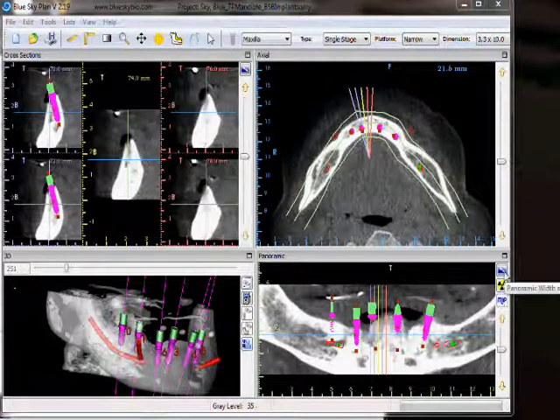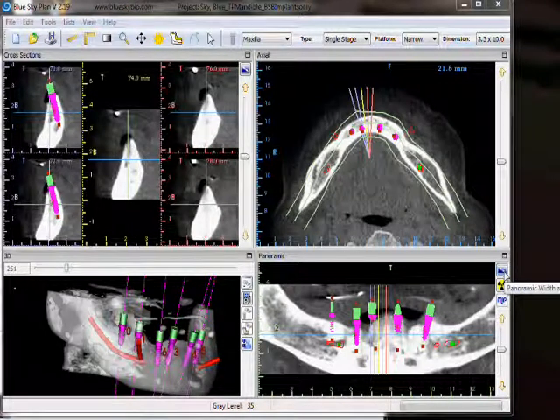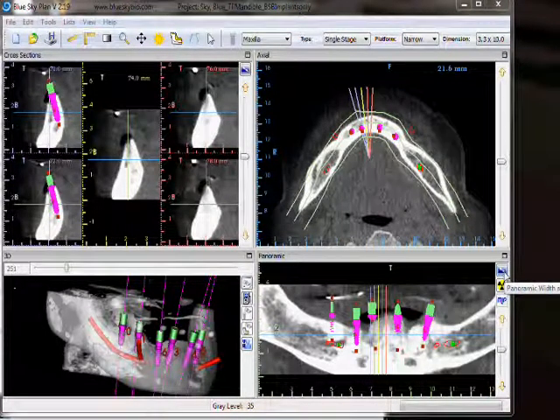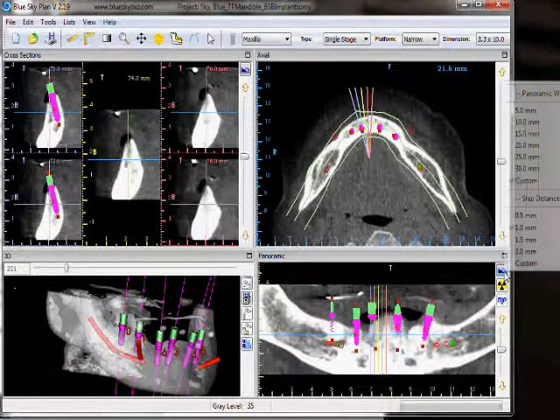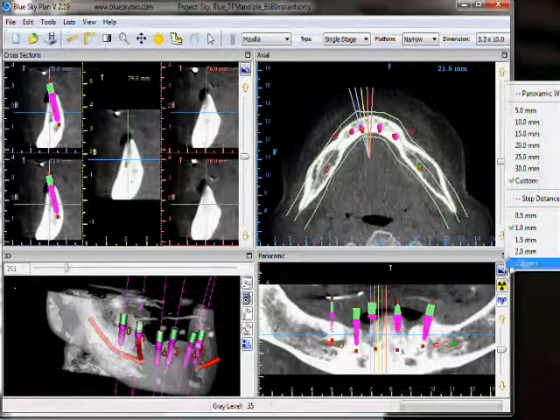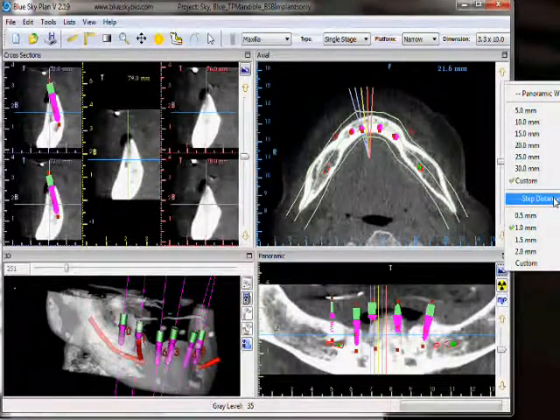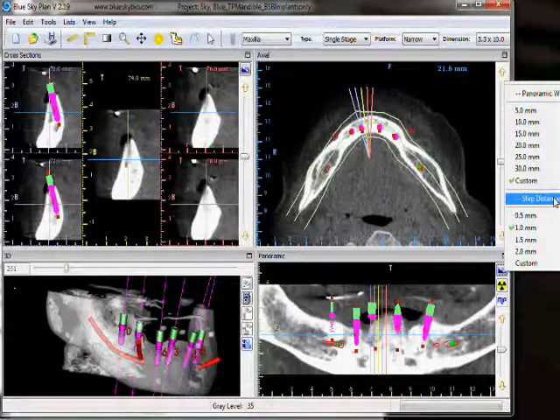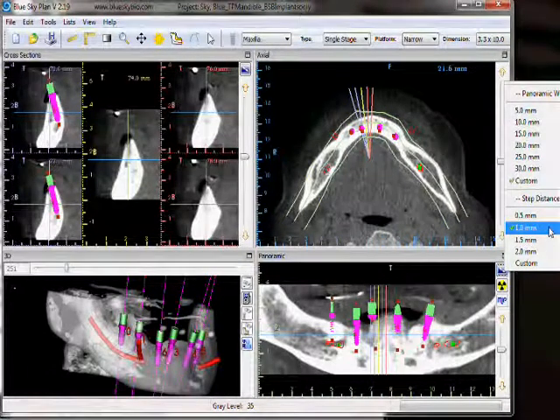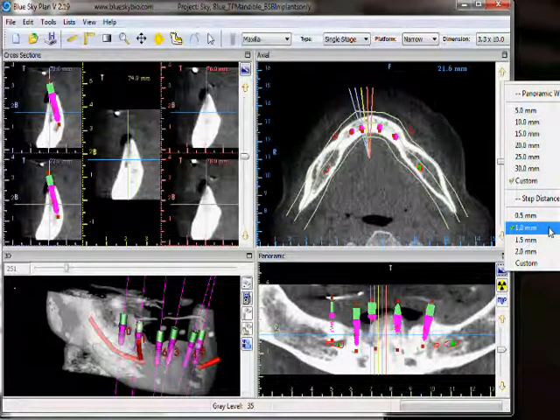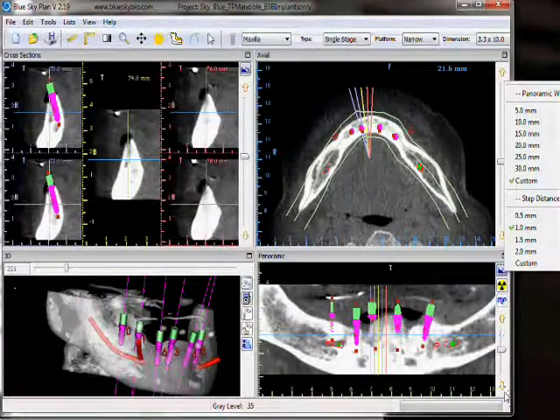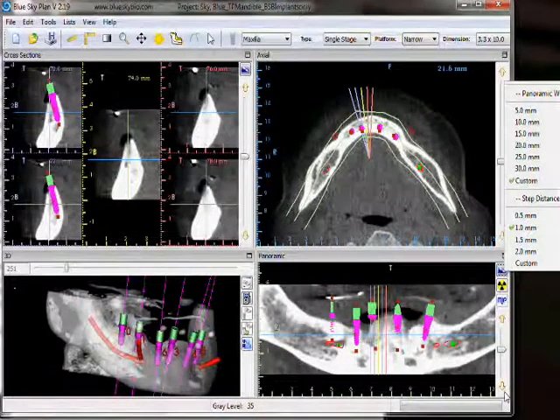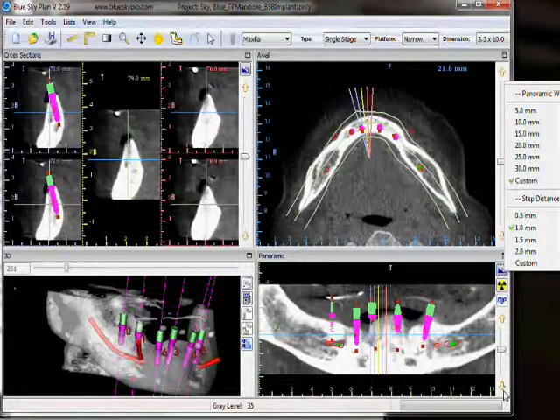We are able to change the distance between each slice by clicking on the top right icon and changing the step distance. The default value of the step distance is set to 1mm, so each time we click on the up-down arrow we will view one slice 1mm away.